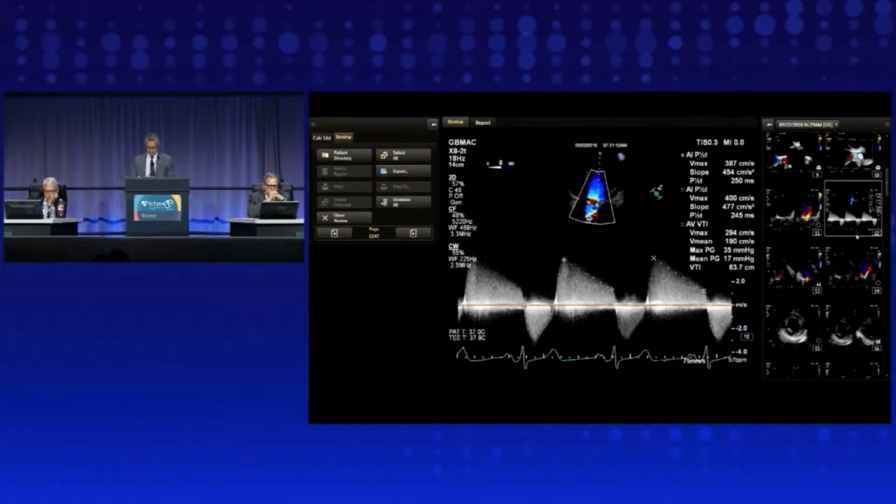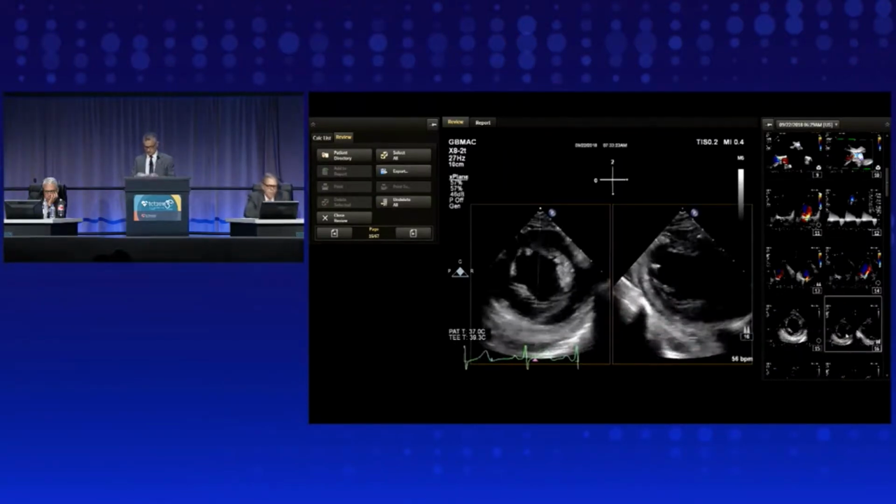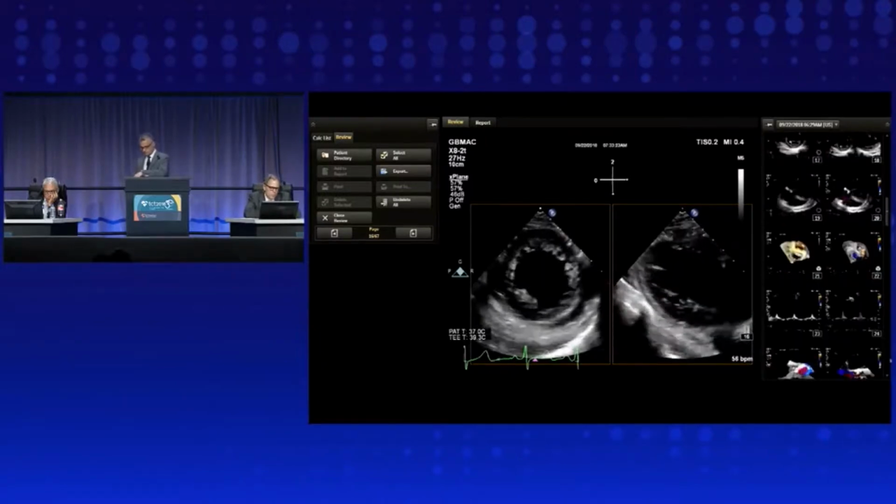We also took a moment to assess the pressure half-time as a quantitative measure for AI, and we measured 240, which is close to severe, just on the border between moderate and severe. In some guidelines, that would be considered severe for sure. Here's a short axis of her left ventricle, certainly preserved LV function.